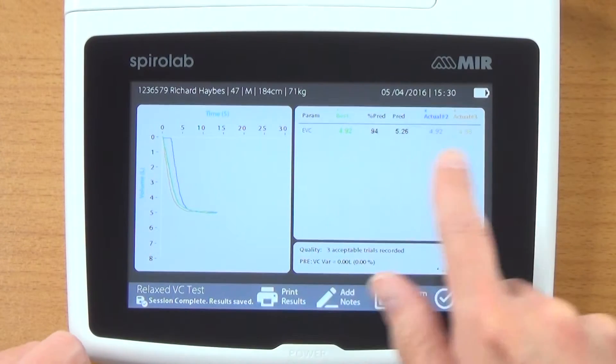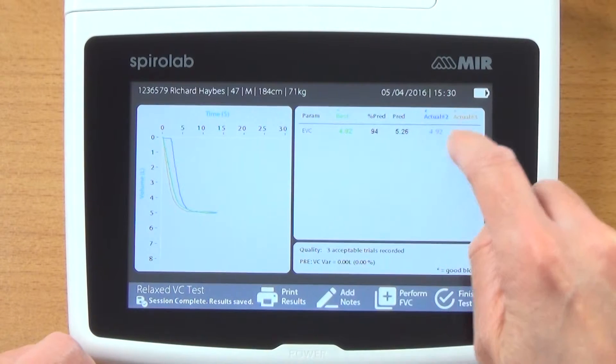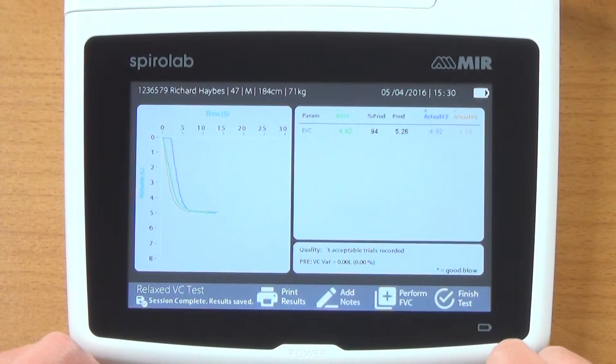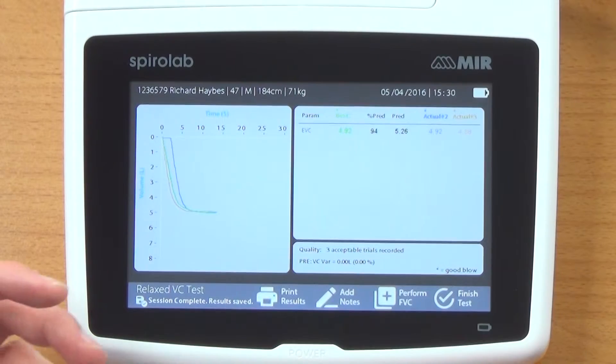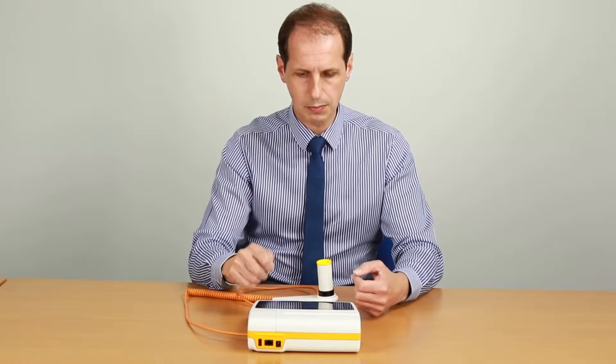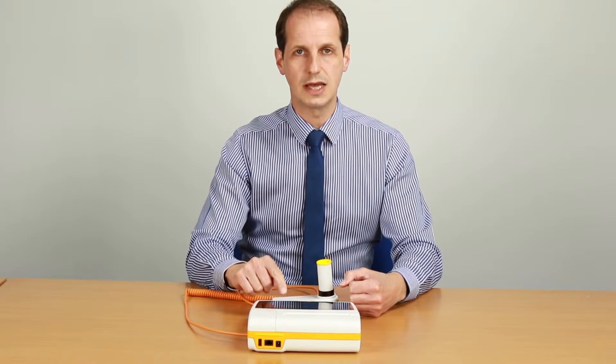Here are my three graphs and my results — three tests. My best one, actual two, and actual three. It says there were three acceptable trials recorded with zero variation between them. You can add some notes if you wanted to — for example, if the person had been coughing, laughing, out of breath, or not feeling well. You could print that off, but I want to actually perform a test, so I'm going to do a forced vital capacity now.